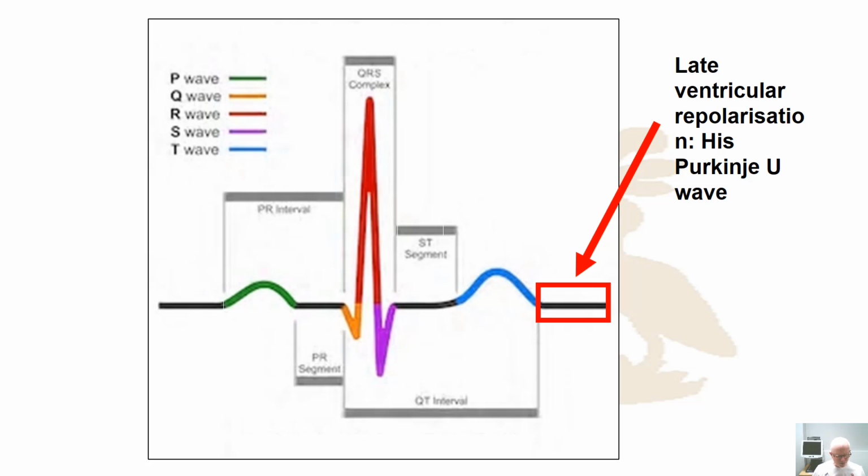So you can see how we've linked the key actions, that is the activation of the atria and the ventricles, to the key structures of the heart in relation to the change in the electrical activity across the heart throughout a single cardiac cycle. And so you can see how the ECG can be used to identify, if these responses looked abnormal, we'd be able to make good determinations about what's going on at the heart, because we understand how each of these relates to different components of the heart and different time domains of the heart.